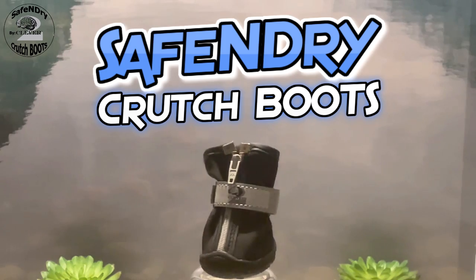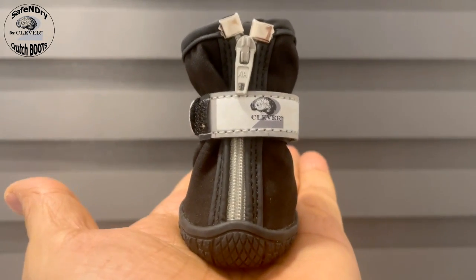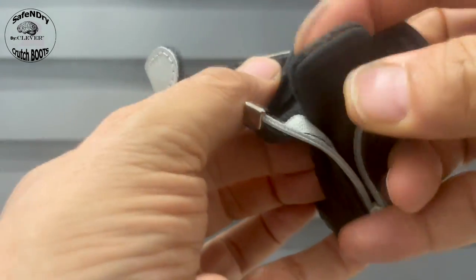These little marvels are designed to fit snugly onto your crutch tips, transforming them into powerful allies in your quest for stability and safety. They're equipped with anti-slip rubber soles, and the secret lies in the high-quality waterproof material.